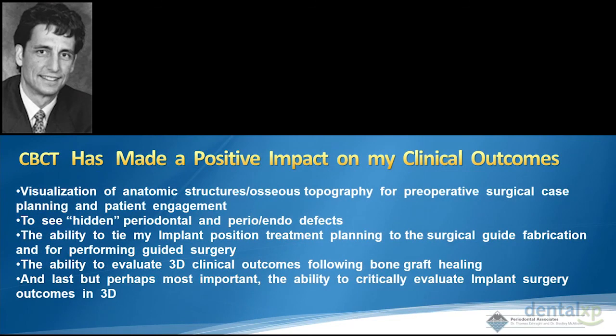So clearly the CBCT has made a positive impact on my personal clinical outcomes, and I think it's critical that you utilize it in your practices for these different applications. The visualization of anatomic structures, osseous topography for preoperative surgical case planning, and patient engagement is critical. We also are able to see hidden periodontal and perioendo defects. We've only touched upon some of the advantages of what we see on a day-to-day basis. Again, the sad thing is that very few offices have CBCT technology incorporated into their day-to-day routine.